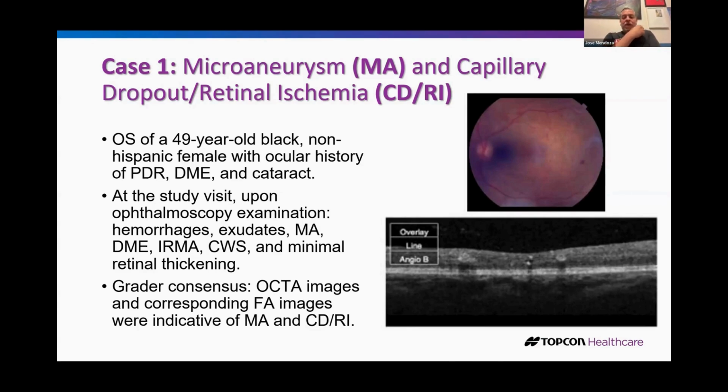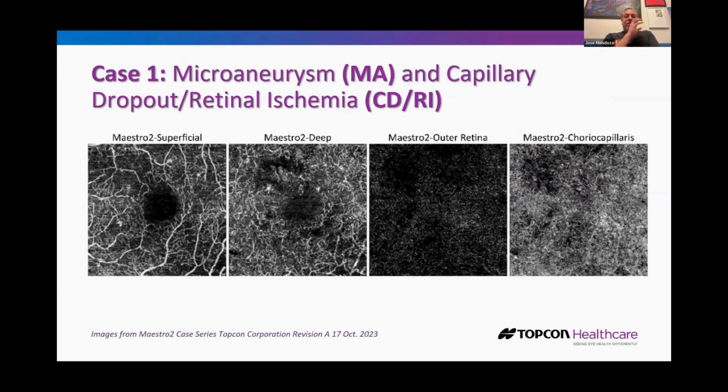So in this slide, you're going to see the characteristics of diabetic retinopathy. Pay attention to the first 2 plexus. In the superficial plexus, you will see the vessels are totally different from the ones that we see in the normal patient. And also, there is more black beneath those blood vessels. Also, in the deep plexus, you could see some white spots that are really bright on that plexus. The next thing that you will see is that both foveal avascular zones start losing their regular rounded shape and start looking pretty different. On the last 2 plexus, there is no data or no pathology, because these are most reflected in the superficial and in the deep plexus.